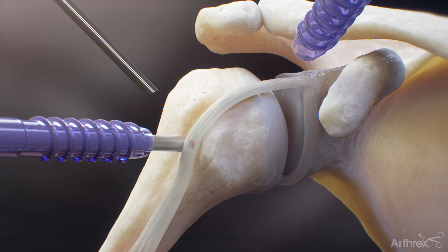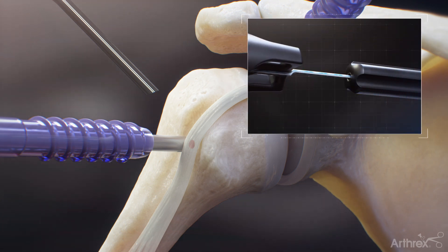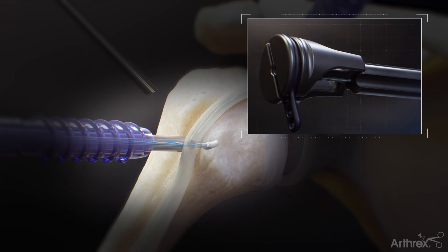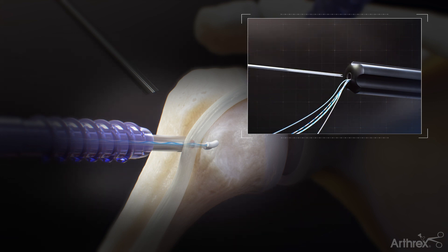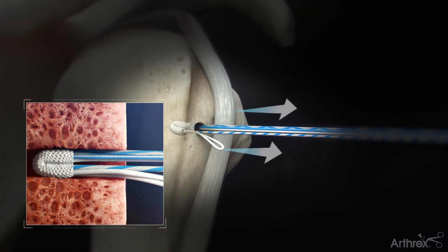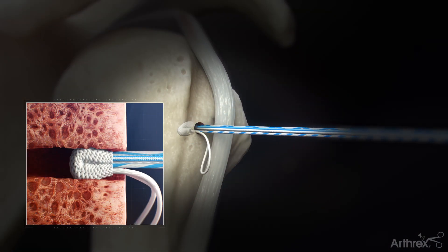Keep the drill guide in place and insert the knotless fiber-tech implant through the guide. Lightly tap on the inserter handle until it is flush with the drill guide. Remove the black suture release tab to remove the sutures from the inserter handle. Lightly pull evenly on the suture limbs to set the anchor in the bone.